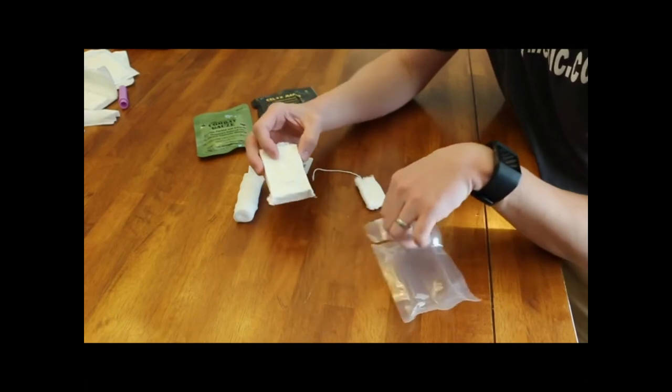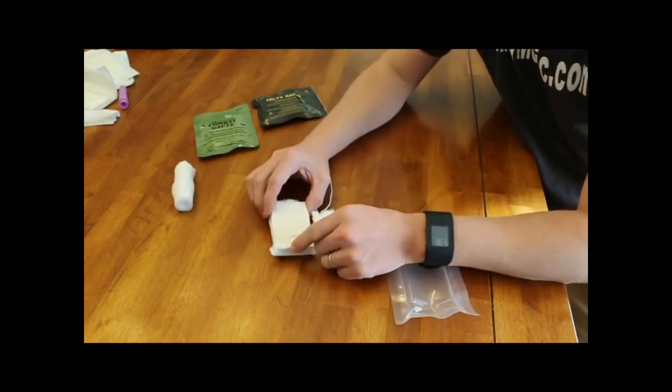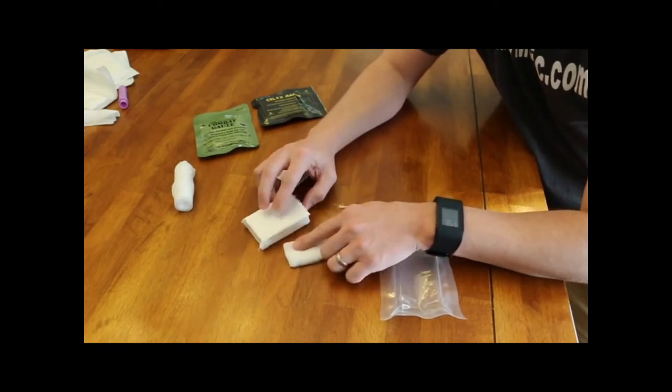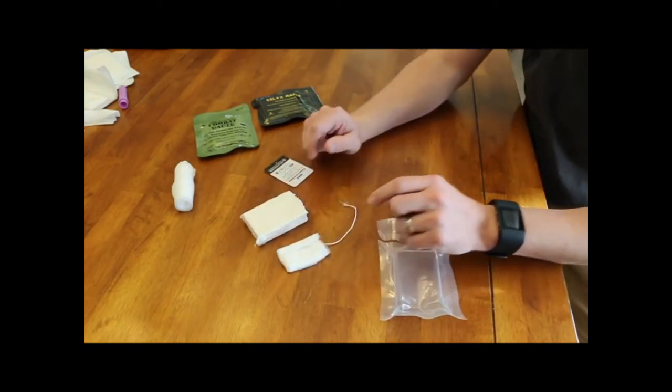And now, without even unrolling this to make it not so dense, you can see a huge difference here, guys. This is it. One of the things that always comes up is in a crap hits the fan situation, where there's no medical help coming, no 911, no hospitals, things like that. Guys say they're gonna use these. They're gonna have these in their bug out bag and trauma kits. Although they should be in your bug out bag, but not for trauma.